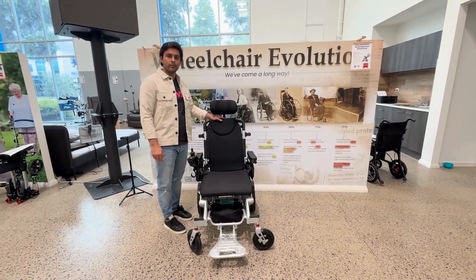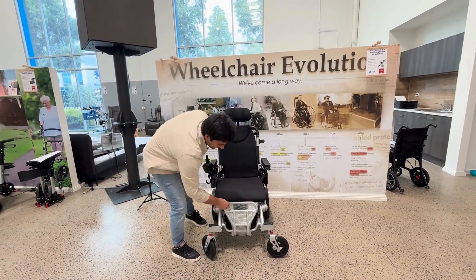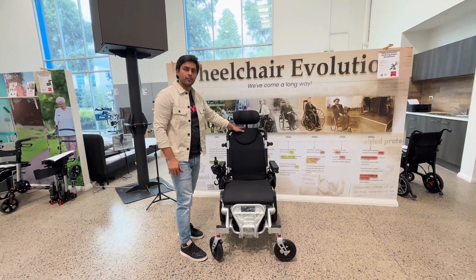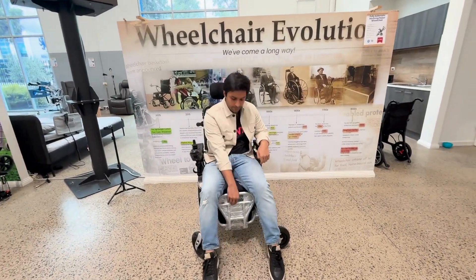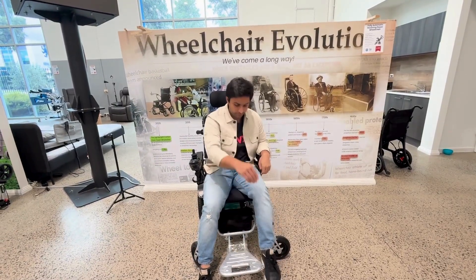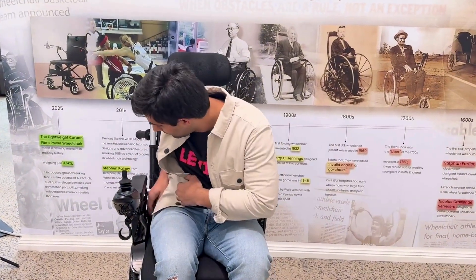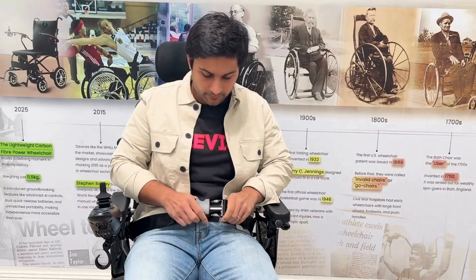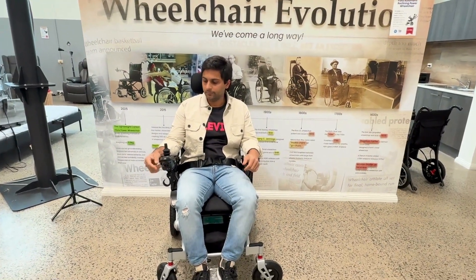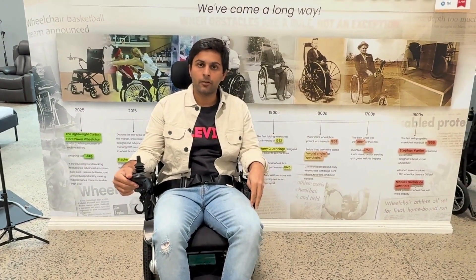Now I will show you how to operate this wheelchair. Before you sit on the wheelchair, always make sure to fold the footrest so that you can easily get in and out. Now you can unfold the footrest. Make sure your safety belt is on. You can turn on the wheelchair now. This wheelchair can go from one to six kilometers per hour, so always make sure that you adjust the speed according to your convenience.